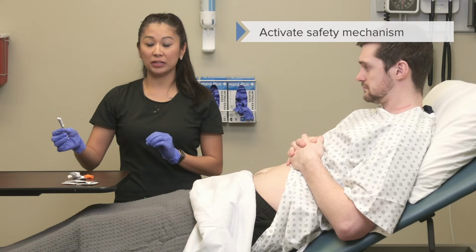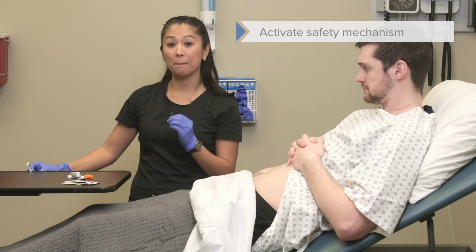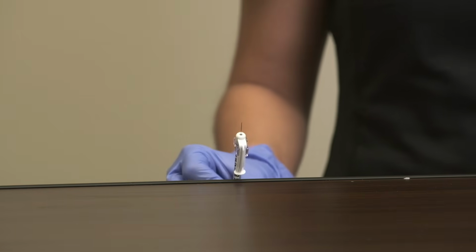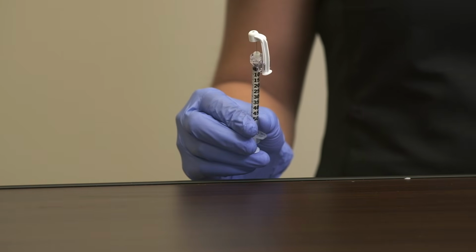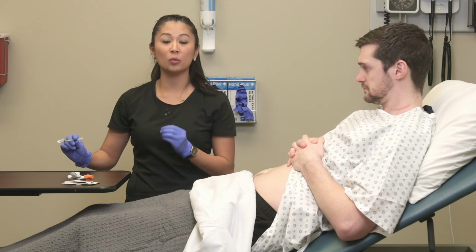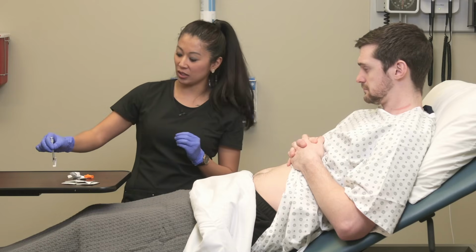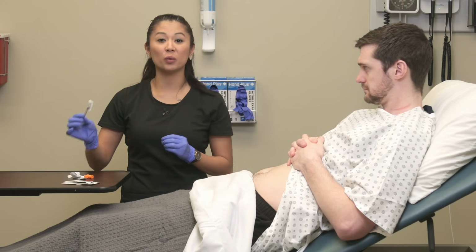As soon as I've injected, I want to make sure to activate that safety mechanism immediately. Now, I'm using this on the bedside table. This way it stays away from me and my patient. Also, notice we heard that click. That's the best way to know that it's locked and safe. So watch this. That's what we want, so this doesn't slide down and we know the needle's protected.